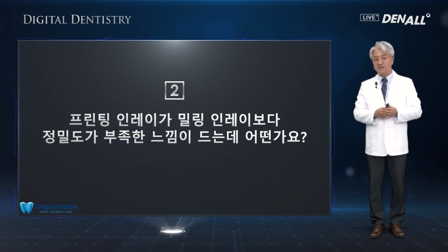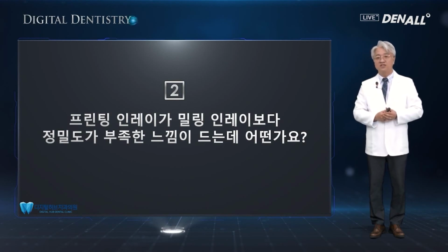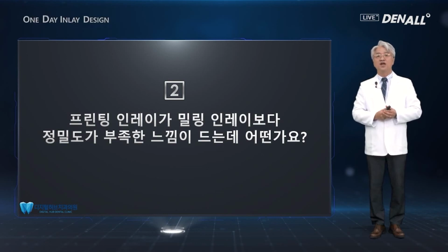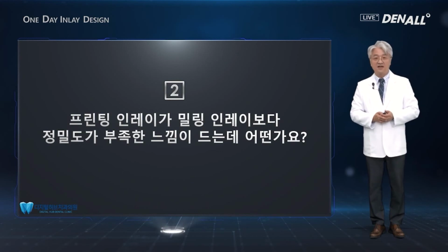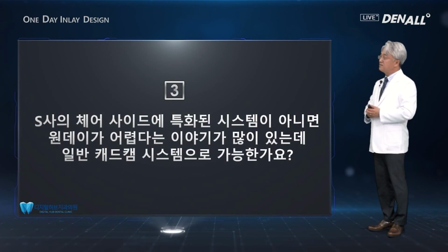And as I showed you with actual cases, as the precision level keeps improving, I believe that very soon it will be as precise as milled inlays, in my opinion.